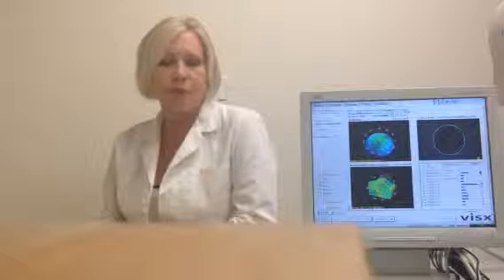And this is very important because after the procedure, people are often amazed and they ask me, well, what was my vision before I had the treatment done? How bad was it? And a lot of times people have 20/400 vision. They can barely see the big letter E. They're considered legally blind if they didn't have the option of glasses, contacts, or laser vision correction. So first of all, then we measure what your vision is without your glasses and contacts, and then what your vision is with glasses and contacts.